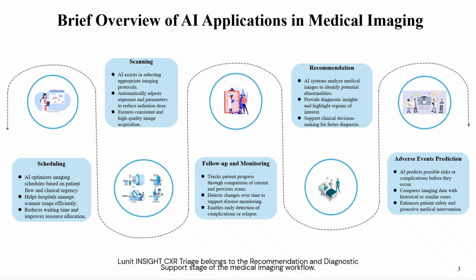Lunit INSIGHT CXR belongs to the recommendation and diagnostic support stage of the medical imaging workflow. As an example of how AI is applied in medical imaging, I would like to introduce the Lunit INSIGHT CXR Triage device.